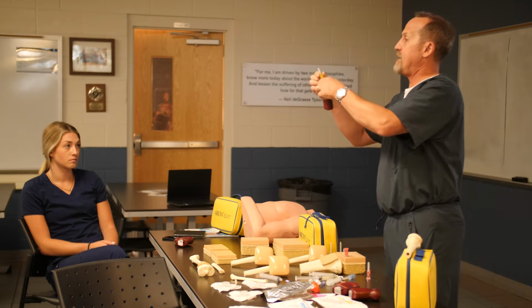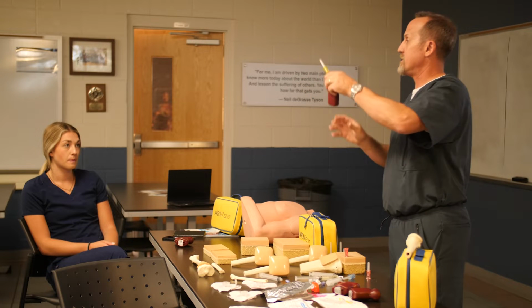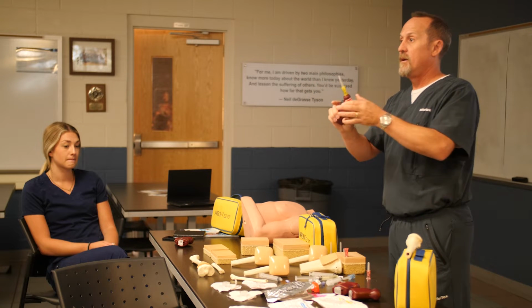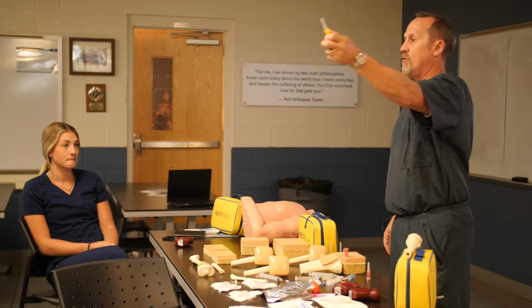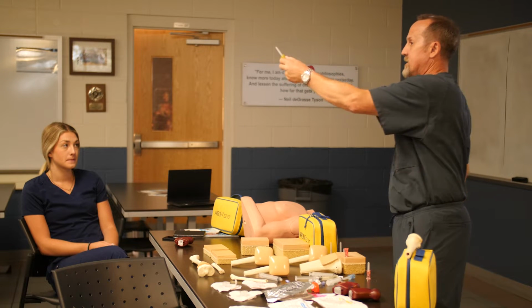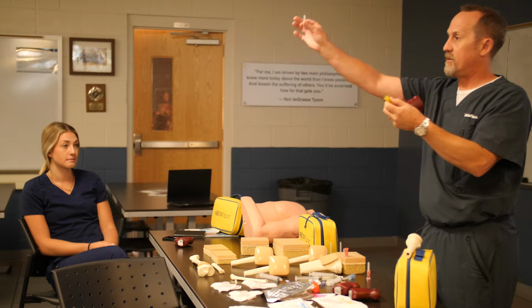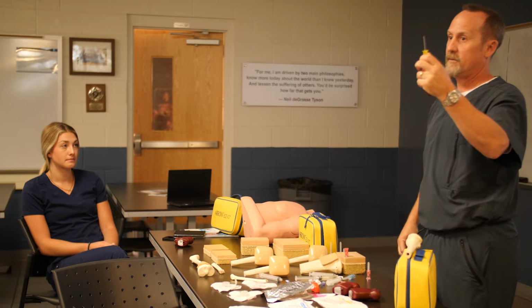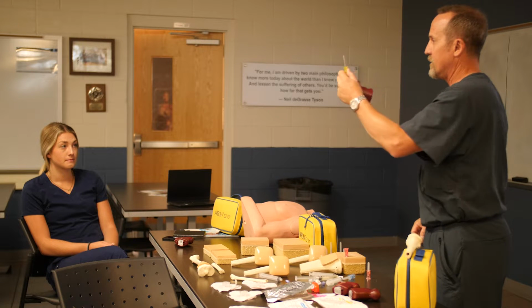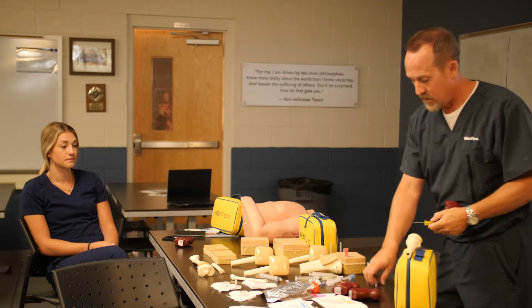first and foremost, it's a very light magnet that it sticks on so it doesn't fly off when you're moving around. But when we're going to take the needle cap off, I always say cradle the gun and hold on to the actual needle set, slide the needle cap off. Always make sure you see black lines there before you engage the patient. Okay? Does everybody understand that?